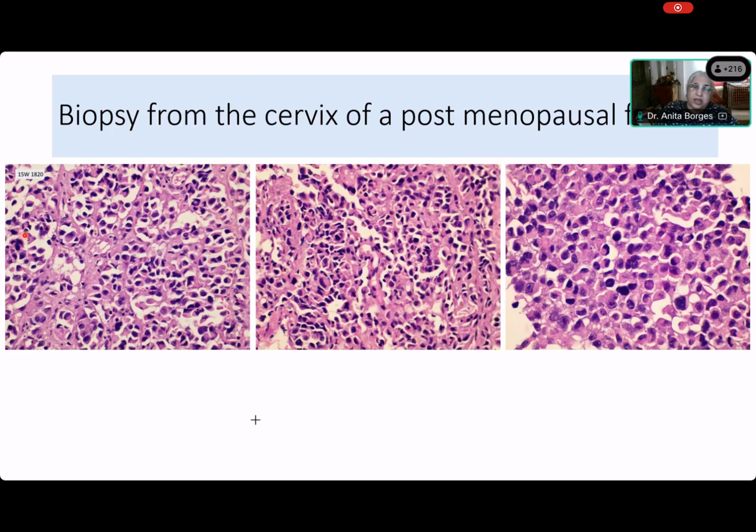So now don't talk about basal cell carcinoma because it doesn't occur in the cervix. Okay, so it is some form of carcinoma. Very good. What else? Somebody in the chat box is saying neuroendocrine carcinoma. Very good. Yes, neuroendocrine carcinoma might, and they may have a plasmacytoid appearance. Excellent. And what else? Somebody called Sachina says small cell carcinoma. Yeah, perhaps there's too much cytoplasm for the usual small cell carcinoma.